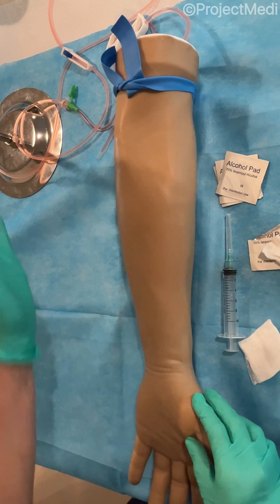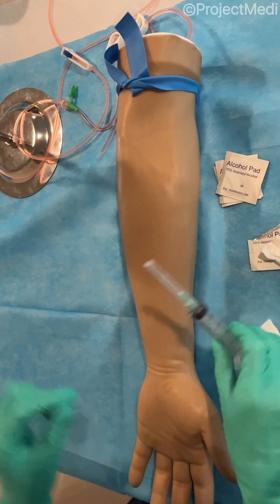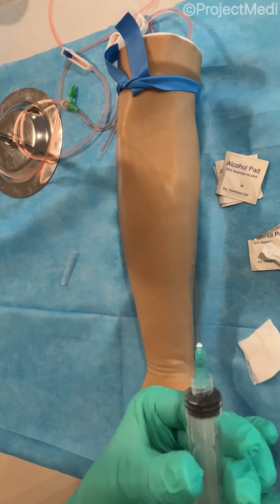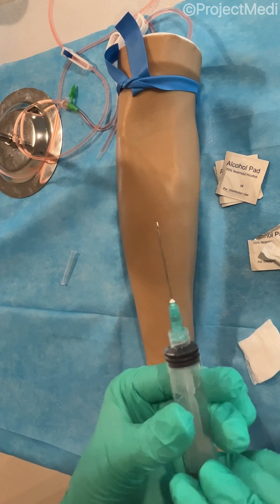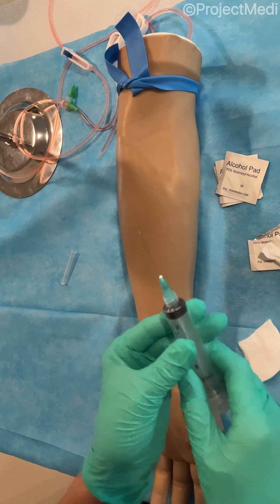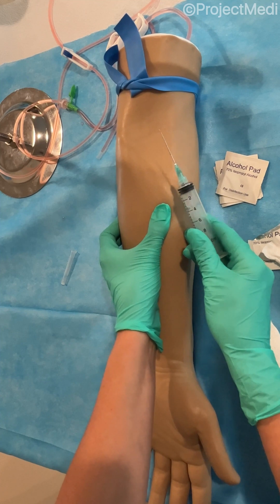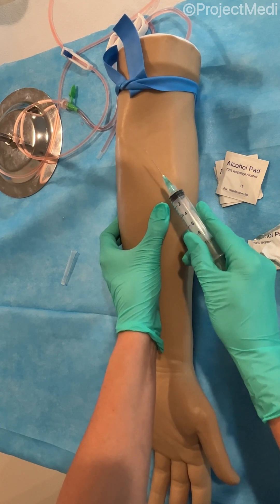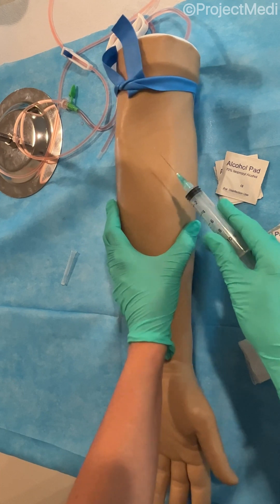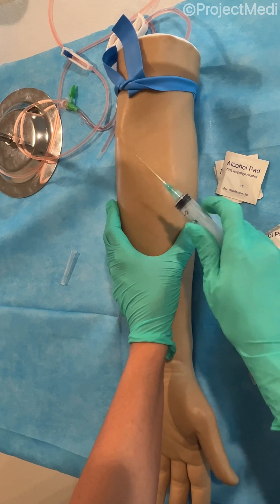Next, you want to allow the skin to completely dry before inserting the needle. When you open the needle, you want to ensure that the bevel is up, which allows for an easier insertion and less trauma to the vein. With your non-dominant hand, you're going to pull back on the vein and use traction with your dominant hand at a 30-degree angle. Veins are very shallow, so you don't want to go in that deep, and you want to enter again at around a 30-degree angle with the bevel up into the vein.